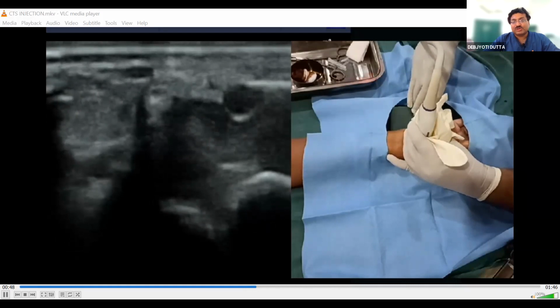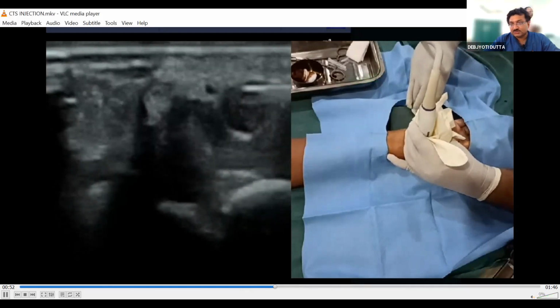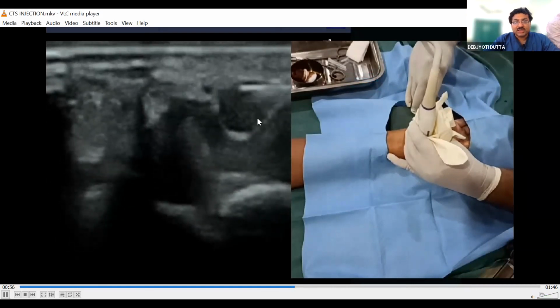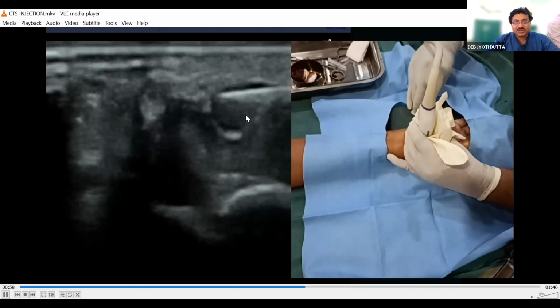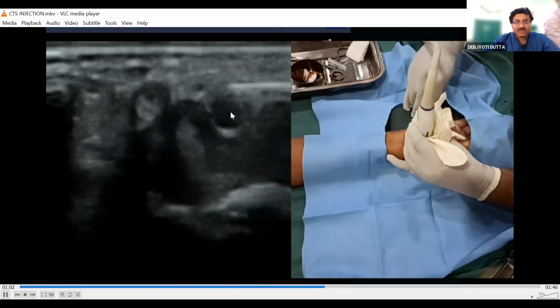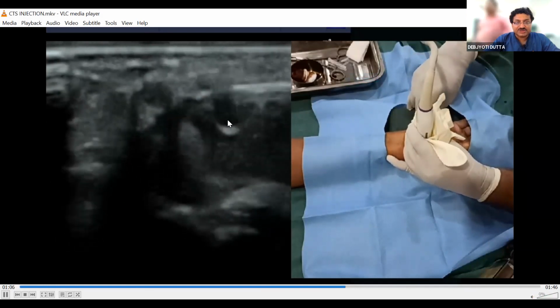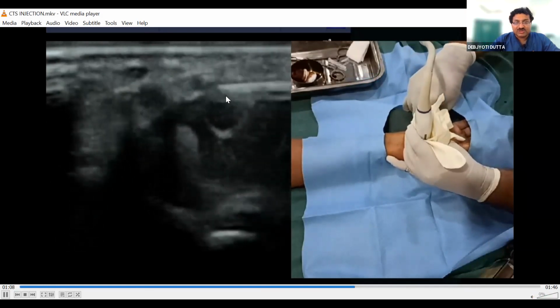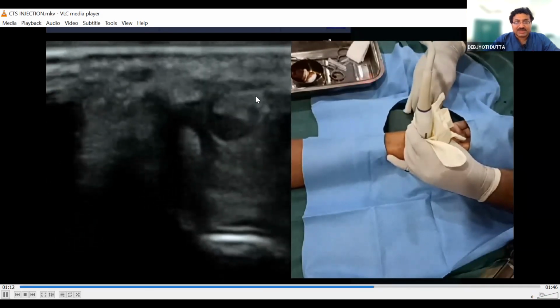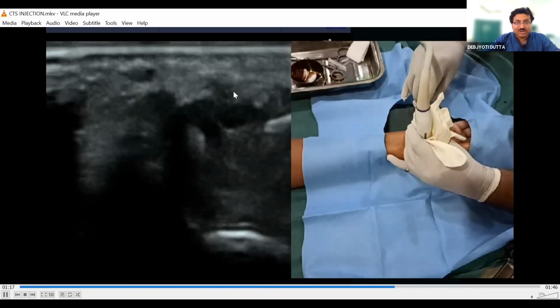Okay, please mute. There is too much noise. Now we are separating it with the fluid from the flexor retinaculum. Sometimes we need to apply a little twist pressure, because in those conditions we need to go for the fenestration procedure. So we are doing the fenestration now. It was very sticky. So now the upper part is done.